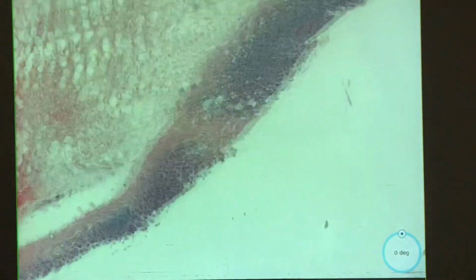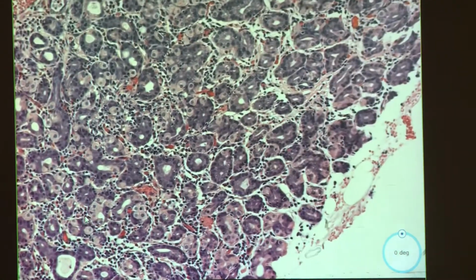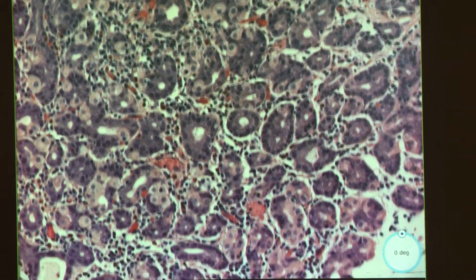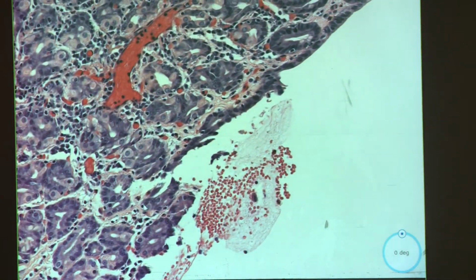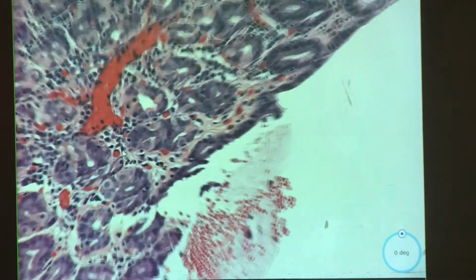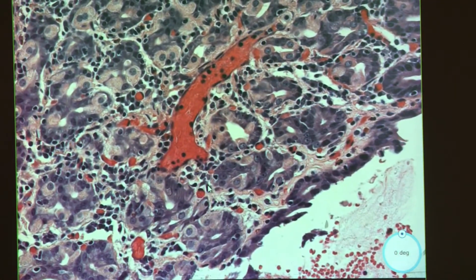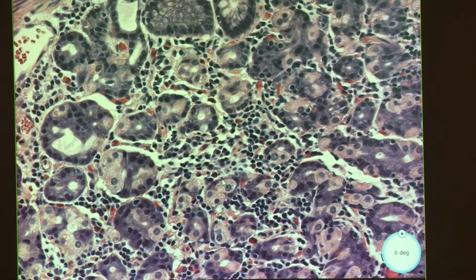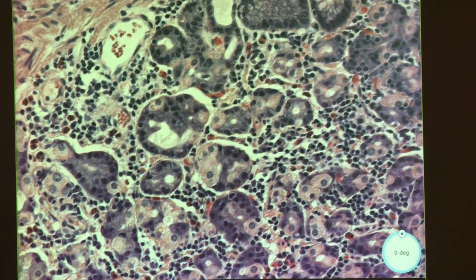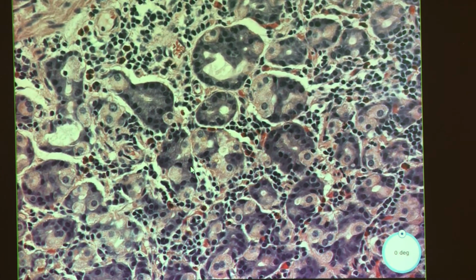So we have gastric mucosa. I'm just looking around, it's very blue, and blue is florid lymphocytes and maybe plasma cells circling through the stroma. There's other stuff in the stroma. Eos. Lots of Eos. Yeah, tons of Eos. And there's also other things. Think inflammation, but bigger cells. Bigger cells.